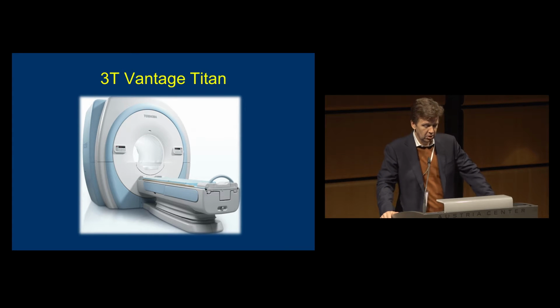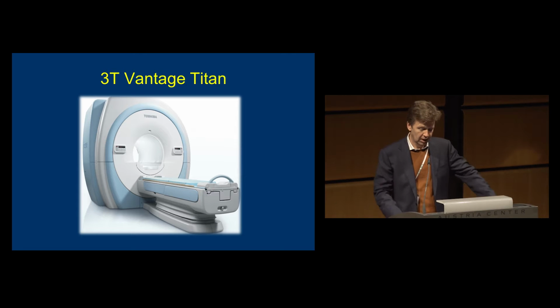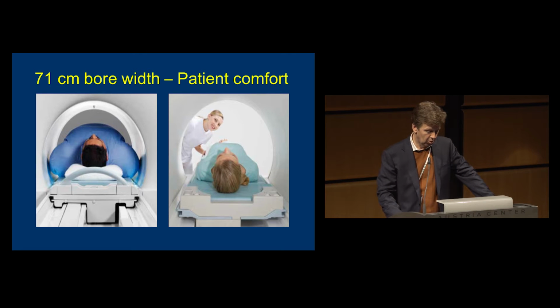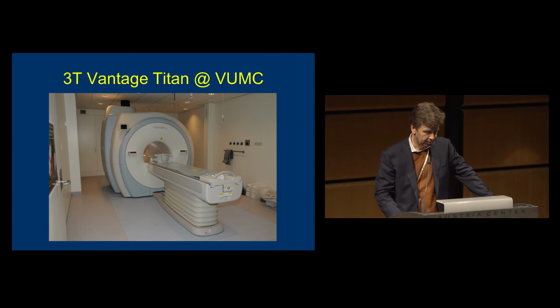So a few pictures. This is just a typical scanner. You can see that the table can move up and down. It's a wide bore system with a not too long tunnel, which is obviously good for patient comfort to have the wide bore. As you can see here, the length is not very long, so it's not a claustrophobic machine, and the patient table can move up and down conveniently.